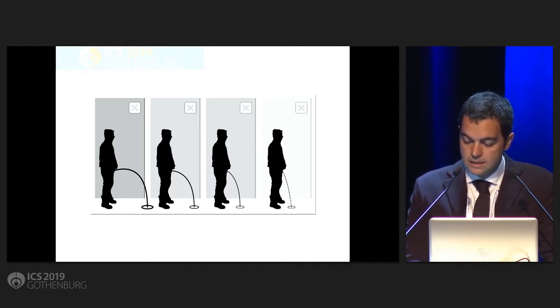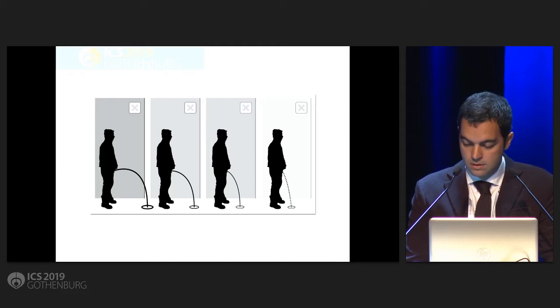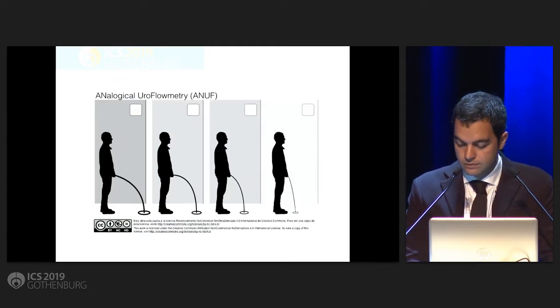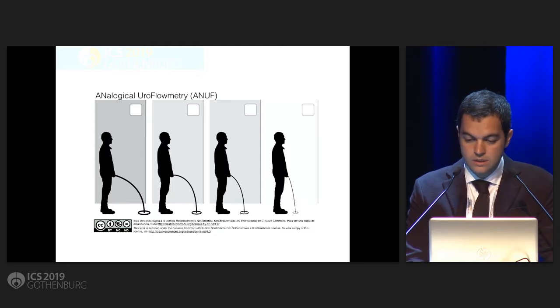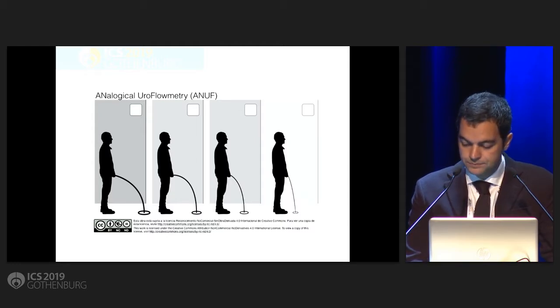With that, we decided to soften the strongest and weakest streams, image 1 and image 4, achieving the final version of ANUF. As you can see now, the upwards flow of the first image is not that evident, and the weakest flow is not discontinuous anymore. None of the pilot cases was considered for the results.